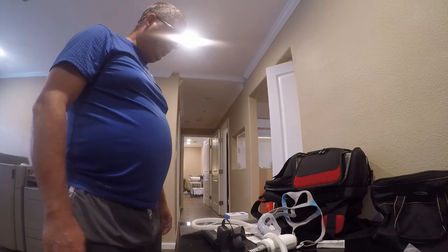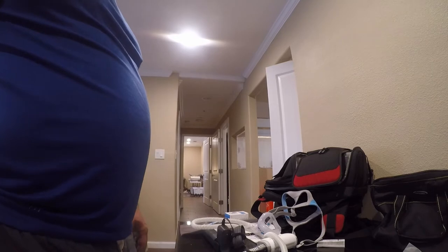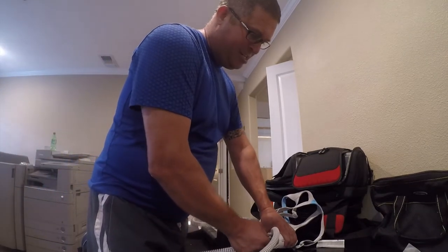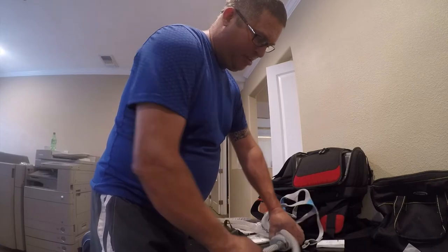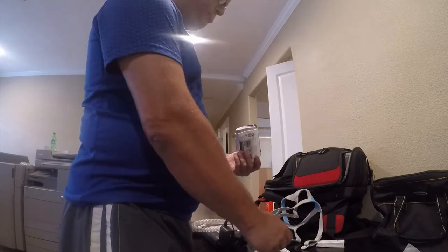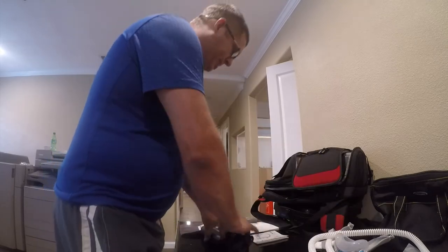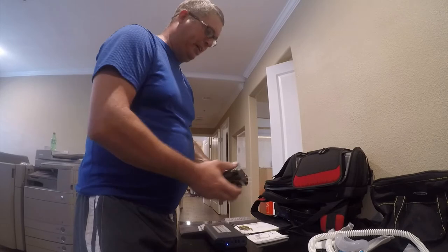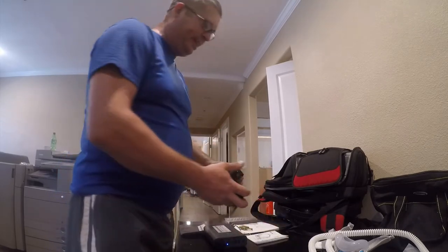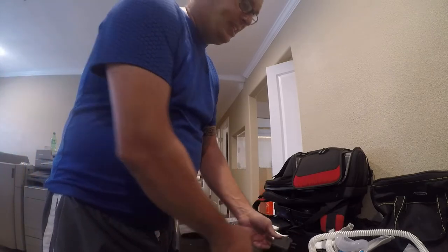Let me see how it packs because that's the next question. You unplug that and then you push on these and it just pops apart — nice and simple and clean. The mask is bigger, and the battery pack is generous. It's almost the size of the machine itself. This is impressive.